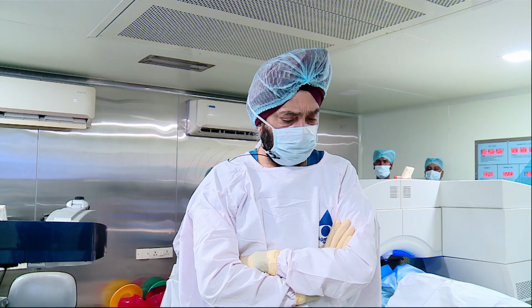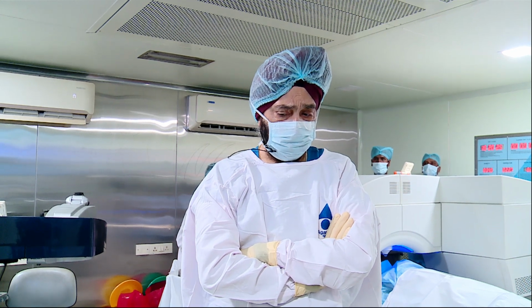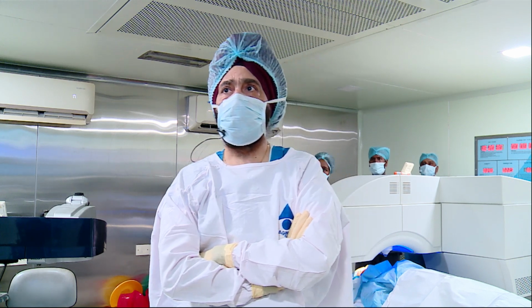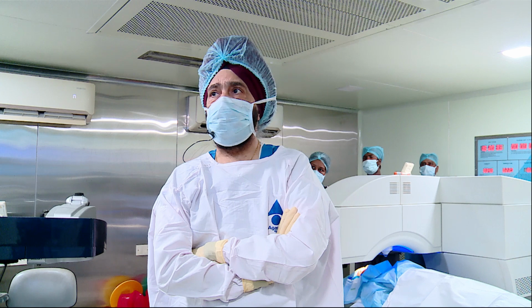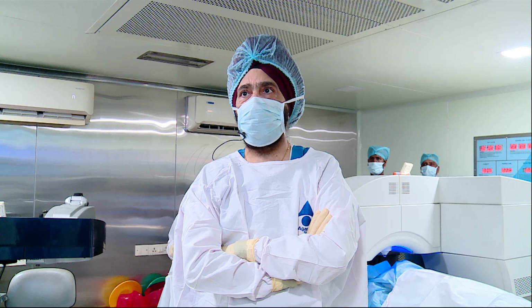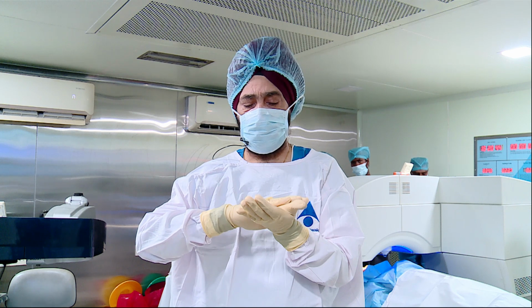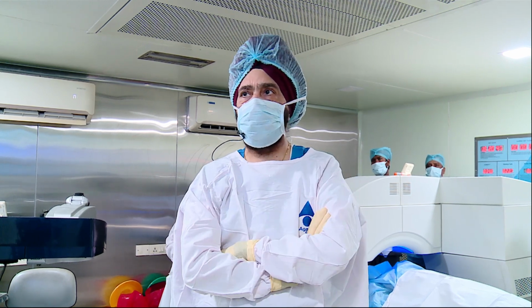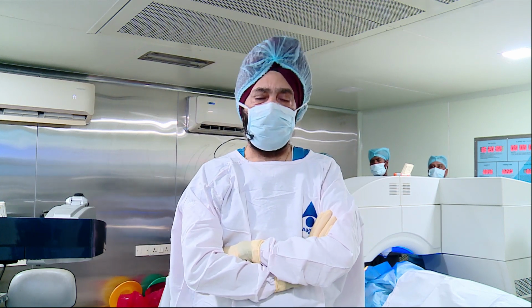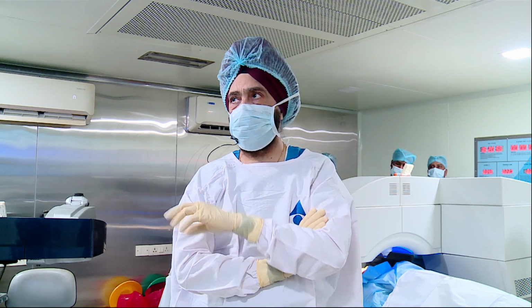I also think one more thing which could be done is, sometimes a person is not docking fast, bringing it slowly down, then even at the last minute, just one more drop of saline and then again drying up the surface would be better. The dry spots will not be there at all. Yeah, so basically it depends how fast you are. Right before I start to bring it down, I just wet the cornea without putting a drop. Actually, it's a small liquid film that I put so that it becomes wet, and that is what is important, because dry spots are where you will get uncut areas. So the adequate fluid has to be there, not too much, not too little.